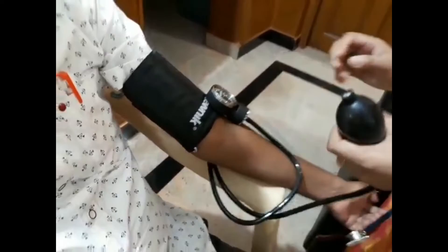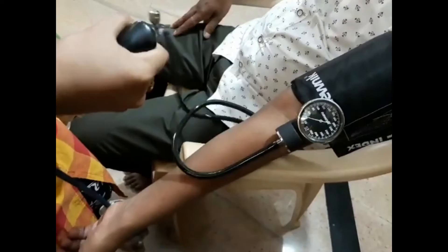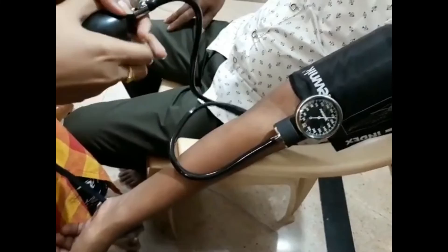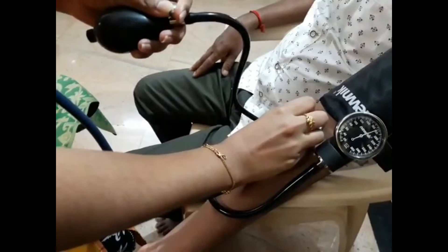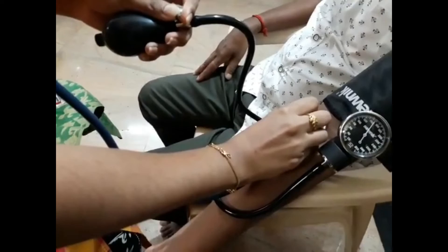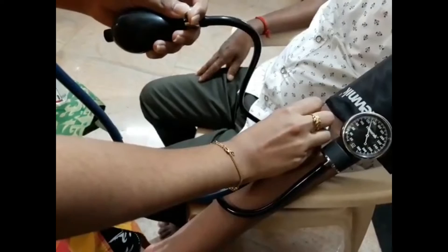Inflate the bulb up to 180 mmHg. Place the stethoscope over the brachial artery. Slowly release the valve. Now I can hear the heartbeat of the patient at 127 mmHg. This is the systolic blood pressure.